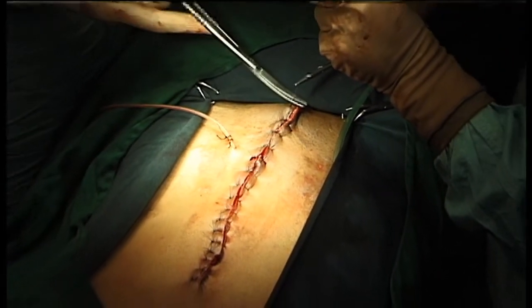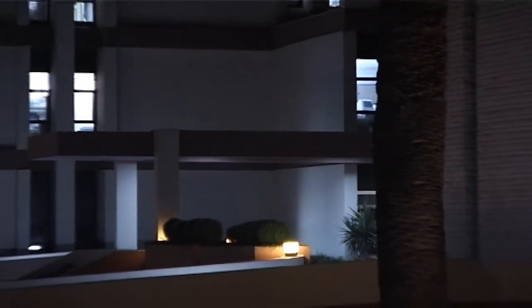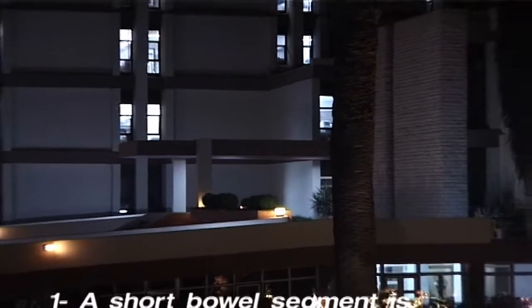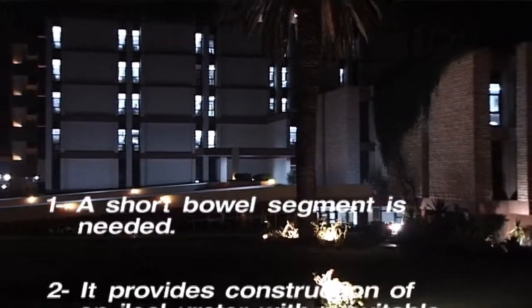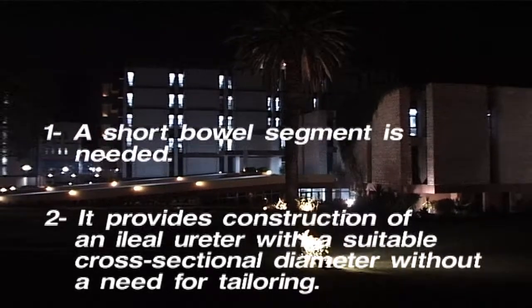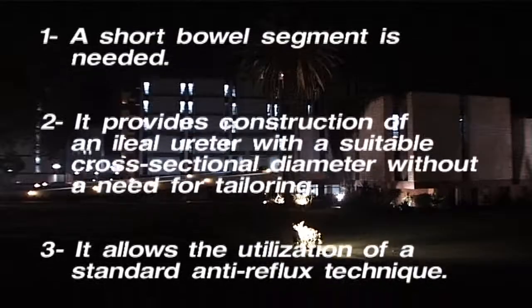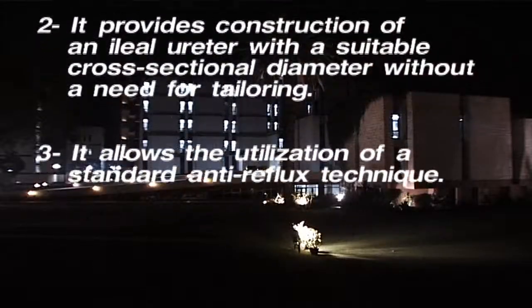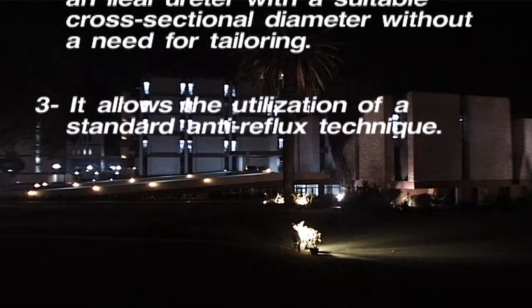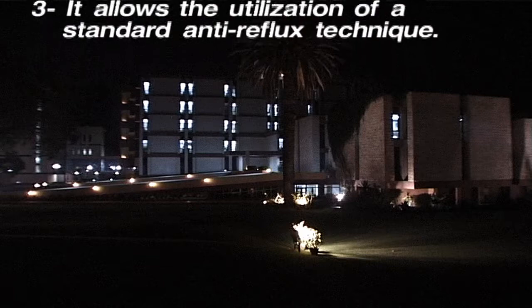The stent is kept for 2 weeks. The proposed technique offers the following distinct advantages: a short bowel segment is needed; it provides construction of an ileal ureter with a suitable cross-sectional diameter without need for tailoring; and it allows the utilization of a standard anti-reflux technique.